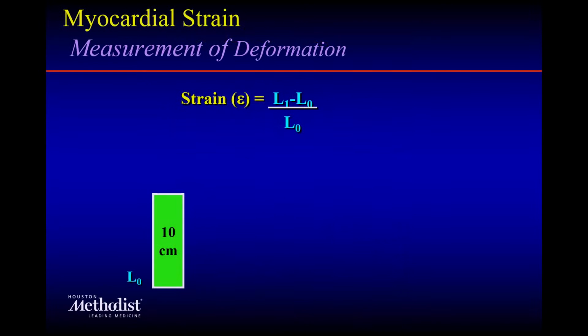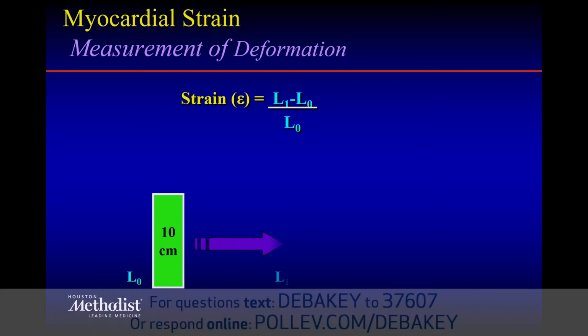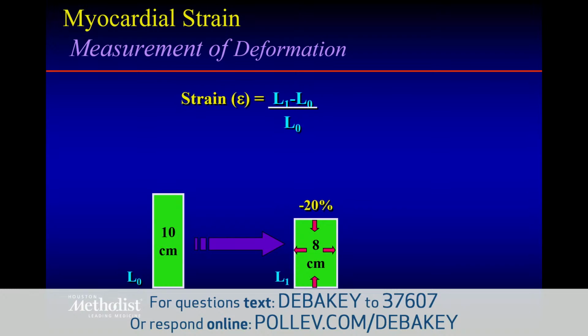And I think that was one of the most beautiful presentations I listened to during that early presentation of this discovery. Now we can use either Doppler or speckle tracking to look at strain, which is deformation of this heart from a certain baseline situation.